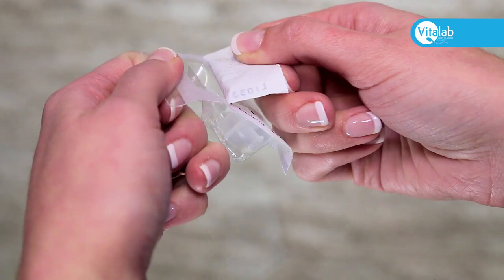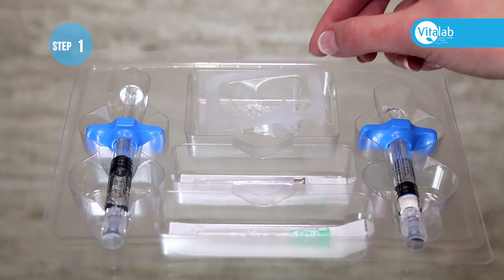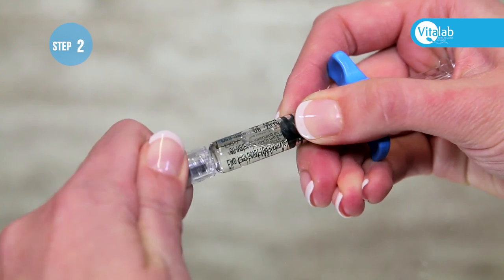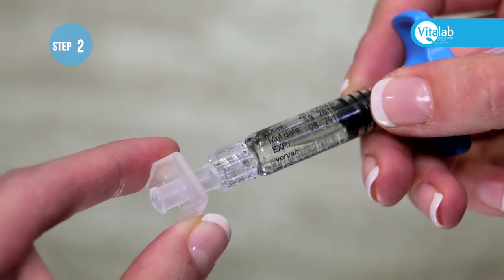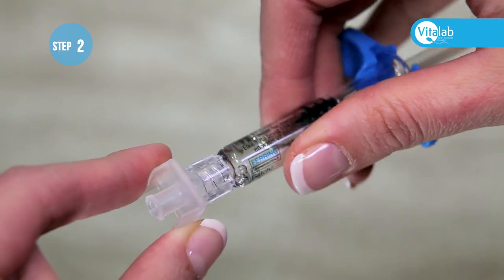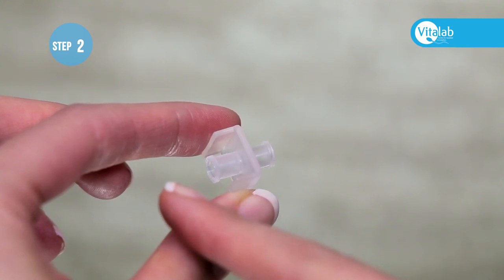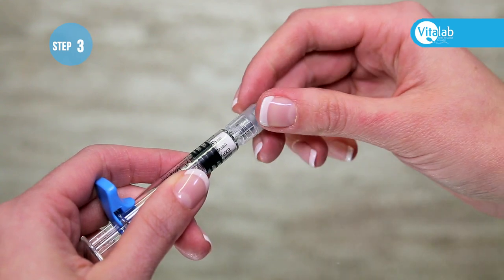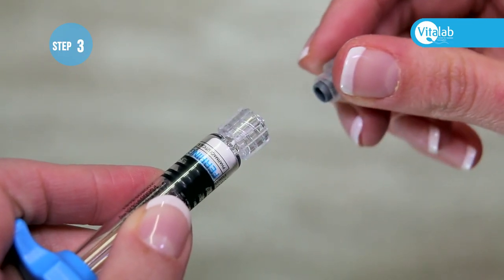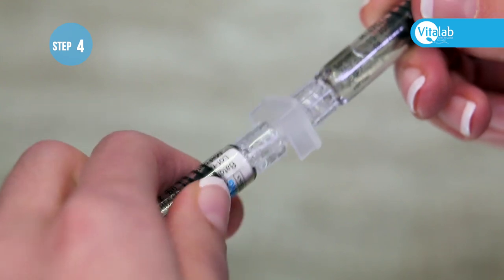Open the connector and place it back into the pack. Take the water syringe and unscrew the protective cap. Pick up the connector and screw it onto the syringe securely — it does not matter which side of the connector you use. Place the syringe with connector back into the pack. Pick up the syringe with the powder and unscrew the protective cap.